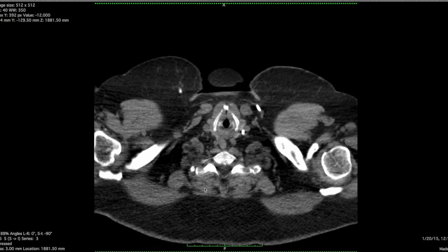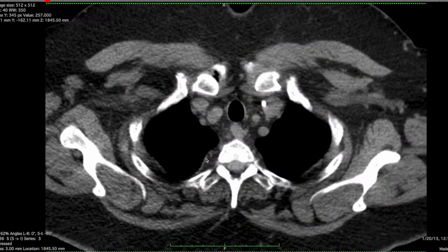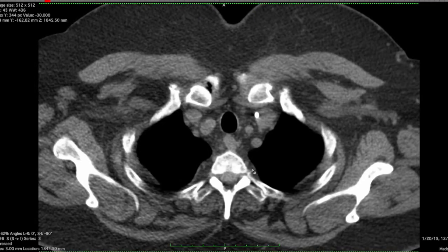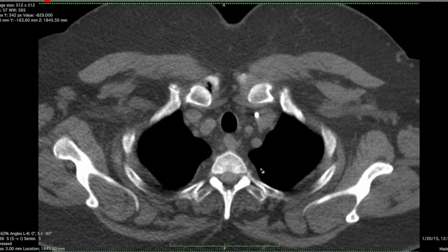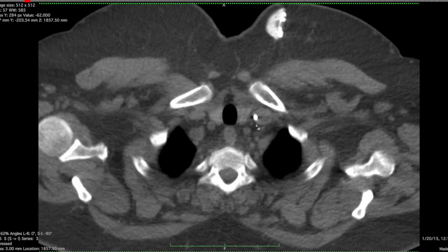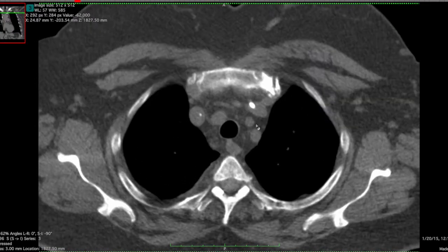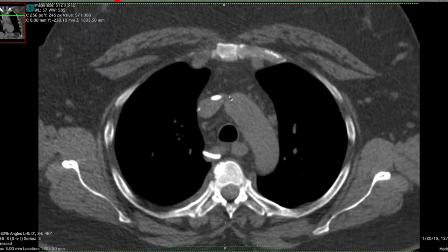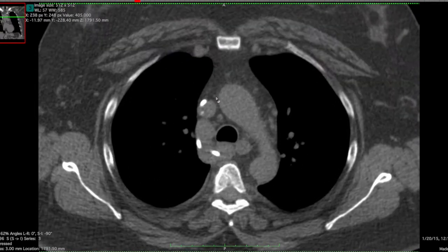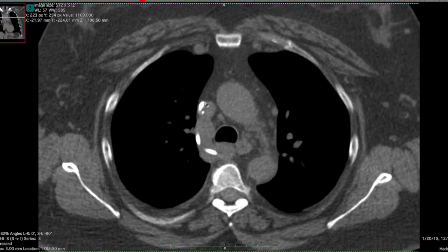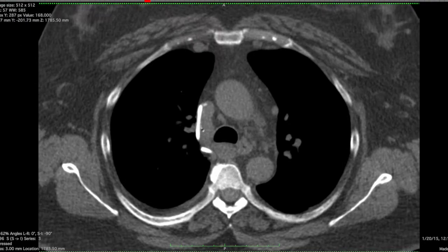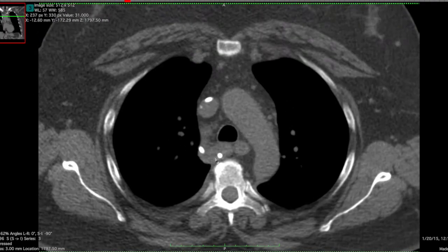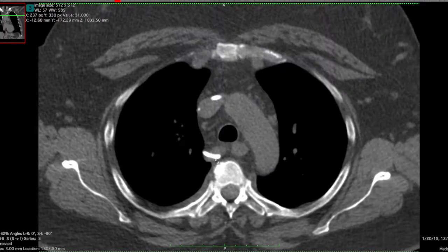For those who need to see CT — I think most people familiar with this would be pretty satisfied with the plain film — but here's that port catheter line that crosses midline through the brachiocephalic vein, comes down here, then goes into the azygous system, azygous vein here, and eventually terminates back here.